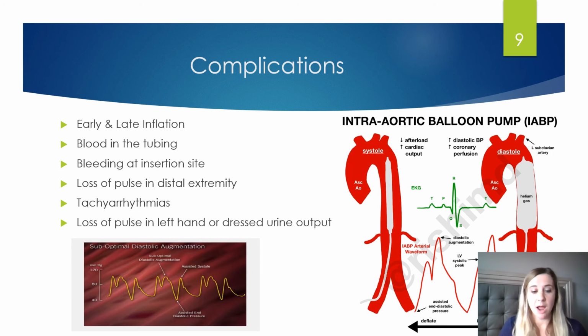All these devices now are automatically timed to inflate based on your QRS. So rarely are we seeing any kind of inflation timing issues, but it's really crucial to know what you're looking for as far as timing.